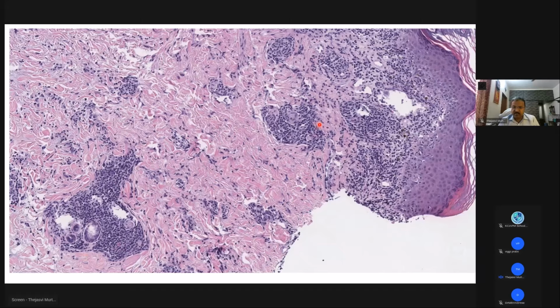This is another feature where the activity is high, discoid lupus erythematosus. So discoid lupus erythematosus can be very active. In the active phase, if you do a biopsy, then you can encounter this also. You can still look for acanthosis and basal cell vacuolar degeneration, interstitial inflammation, as well as periadnexal inflammation also. Perivascular and periadnexal inflammation with interstitial inflammation can be discoid lupus erythematosus also. That you should keep in mind. Apart from mucin degeneration, epidermal atrophy, basement membrane thickening, follicular plugging, so many features are there to diagnose discoid lupus erythematosus. But it can have this form also.